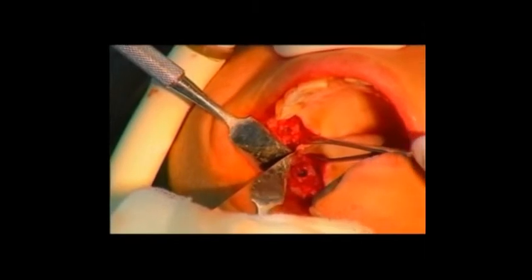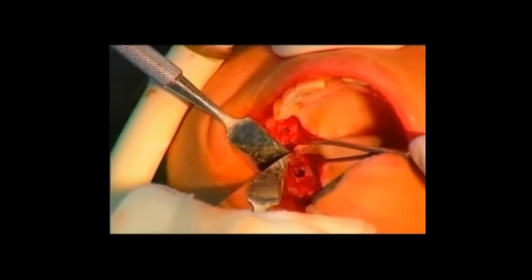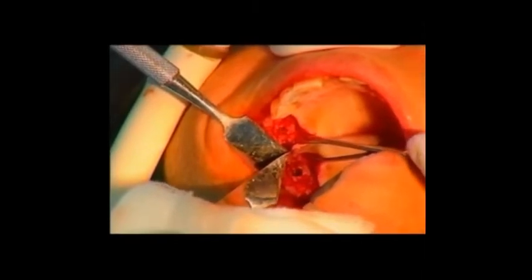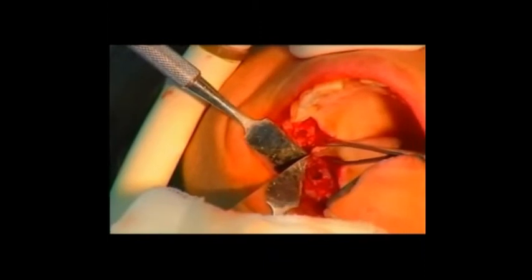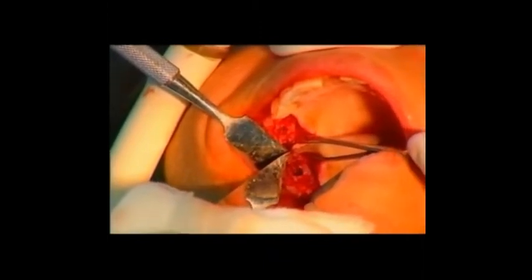In this view, one can see by direct vision the integrity of the antral membrane moving on inspiration and expiration. Visual access to the antral floor via the osteotomy site ensures verification of the antral membrane integrity.